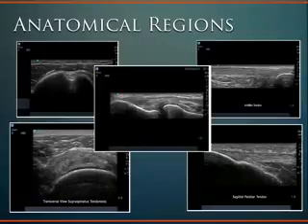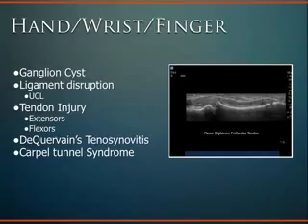So now that we have a sense of what tendons, bones, and muscle are supposed to look like, and we've seen a little bit of the pathology, we'll jump into a couple of specific anatomical regions and get a sense for what you can actually use in a clinical setting. In my sports medicine practice, what we can see, what diagnoses we might be able to use this for, and what they look like on ultrasound, just so you guys can get a sense of that.